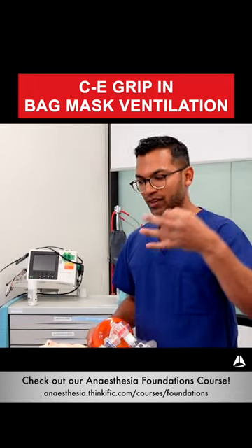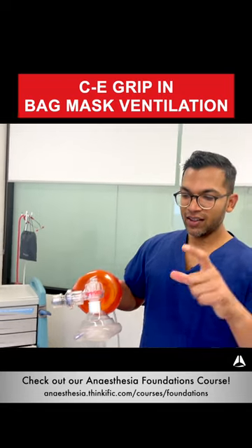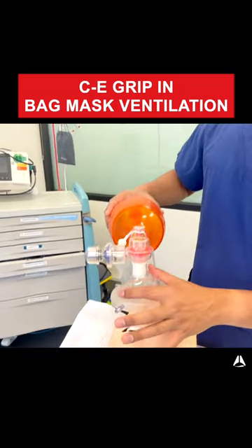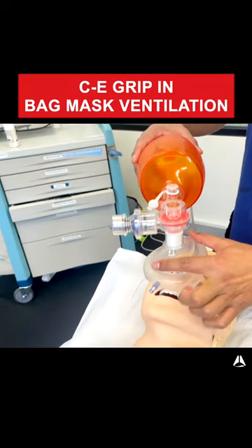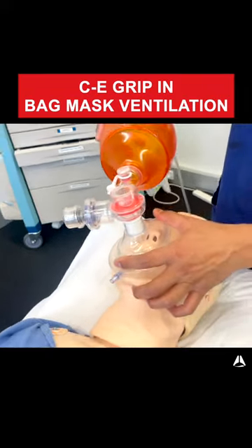The C and E grip: the C is this shape over here. You'll notice that I put my thumb at the top near the bridge of the nose and then my pointer finger just there. That way it can create a bit of pressure across the mask through the top and the bottom of the mask.